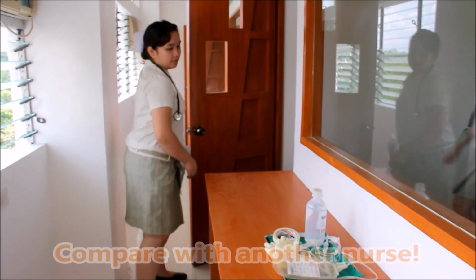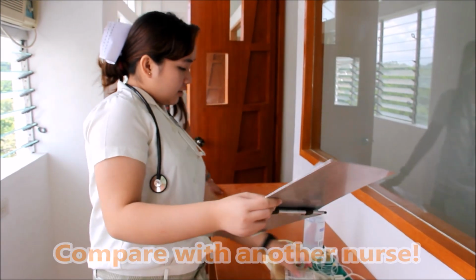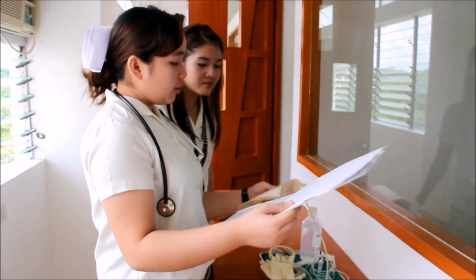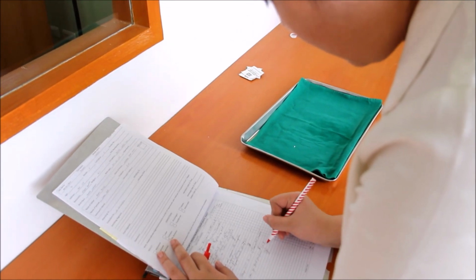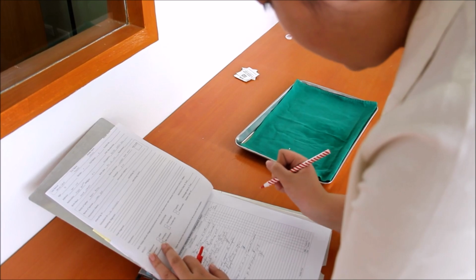With another nurse, compare the laboratory blood record with the client's name and identification number, the number on the blood bag label, the ABO group and RH type on the blood bag label. Sign the appropriate form with the other nurse according to the agency policy.